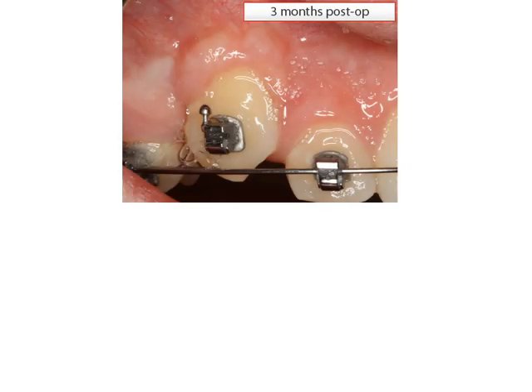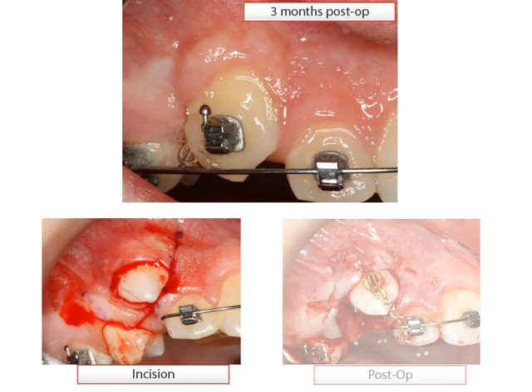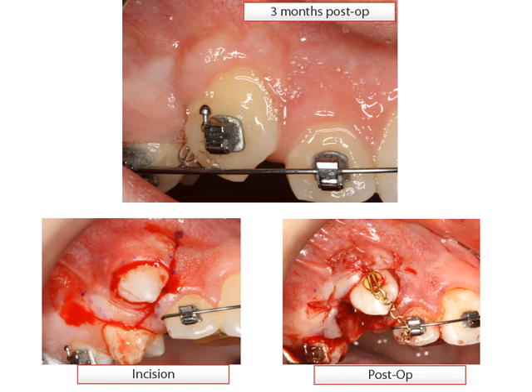As far as the beds that are left from the flaps, I decided to let the distal one granulate in, since there was keratinized tissue on either side of it, and advance a bit of the loose vestibular tissue to cover the medial bed. This is how the flap looked when it was raised, and all sewn up with a bracket and placed at the end of surgery.